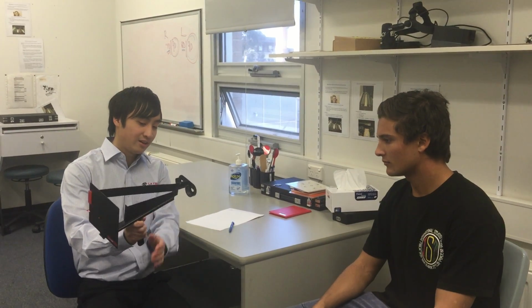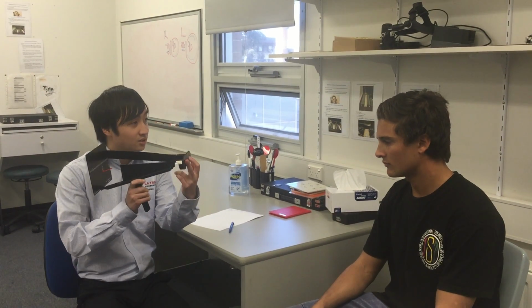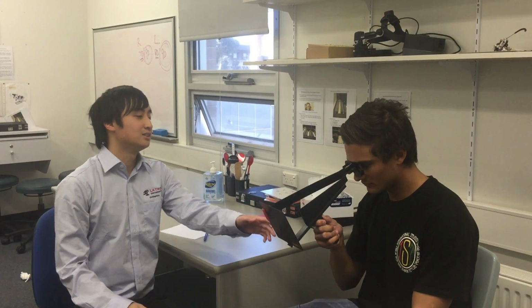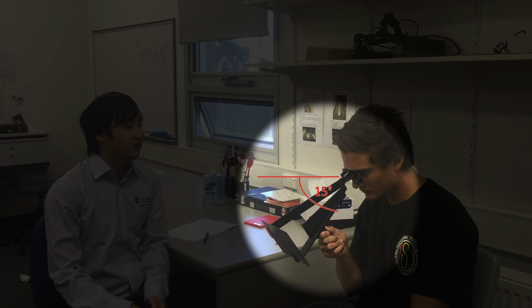So if you see this handle here, I'd like you just to hold that like that and just look through these holes like you're looking through glasses. Okay. Just try it up here. And just hold it as if you're looking at a book. The instrument is to be held at reading position in a depression of about 15 degrees.